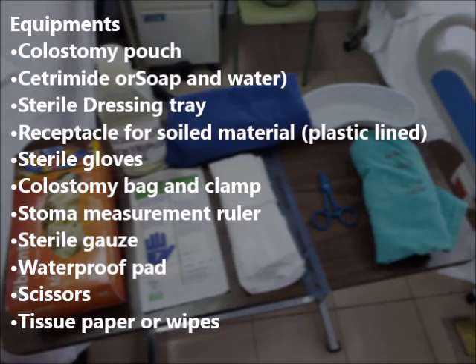Gather your equipment, sanitize your trolley, perform hand hygiene, and get ready to approach your patient to start the colostomy care.